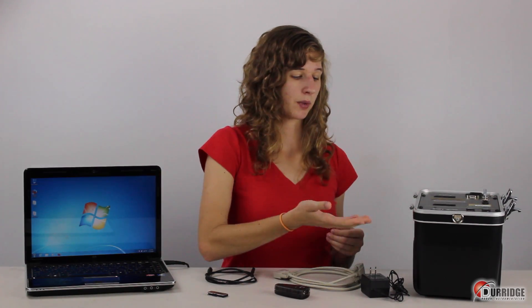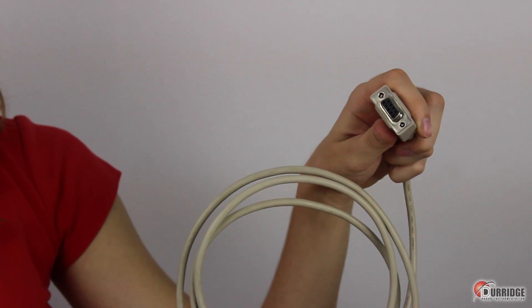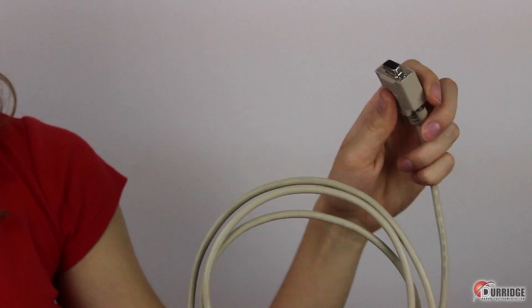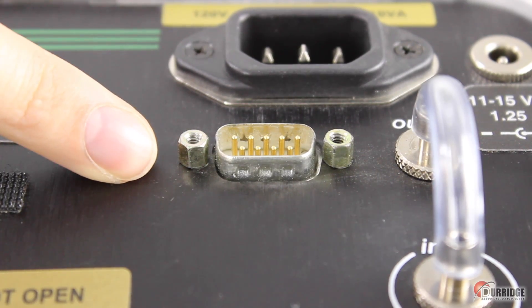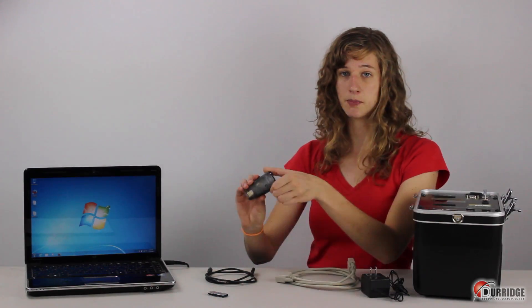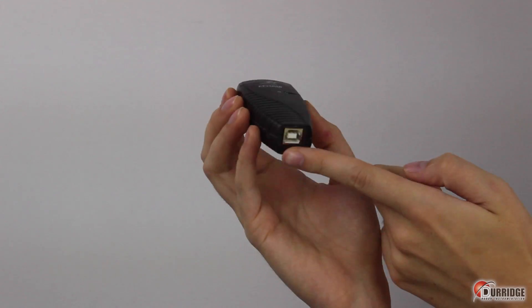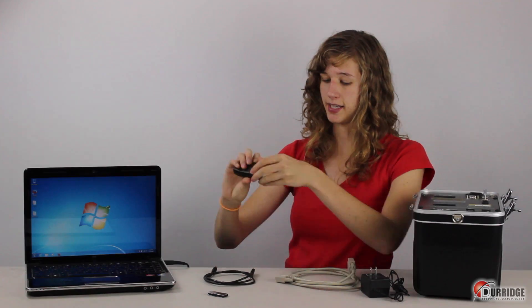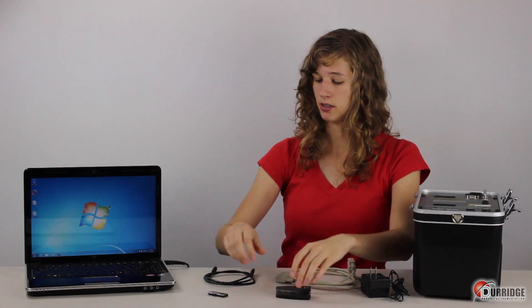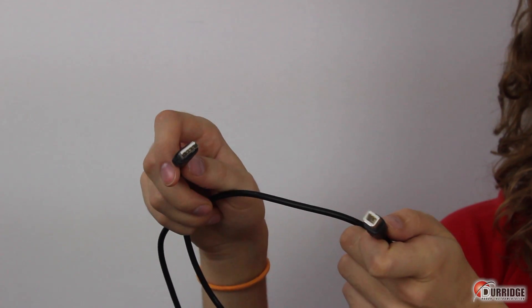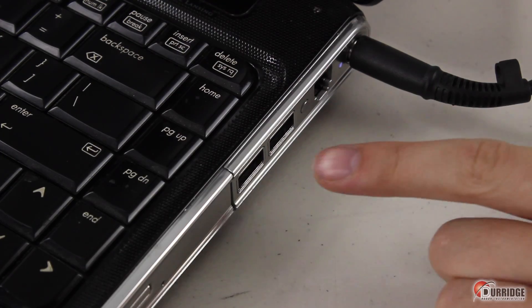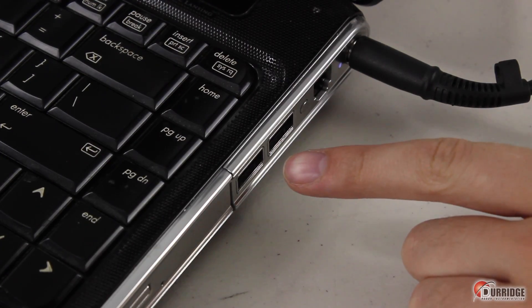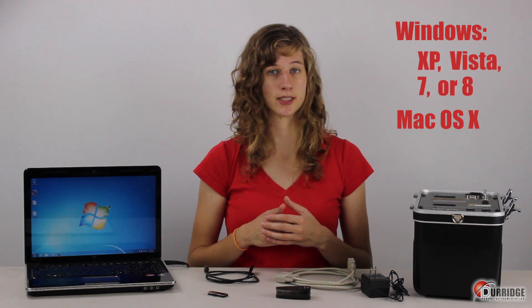This is the RAD7's power cable. You also need a null modem cable that goes into the serial port of the RAD7, and then into the Keyspan USB serial adapter that connects to the USB-B cable that goes into your computer, which can run on any of the following operating systems: Windows XP, Vista 7 or 8, or Mac OS X.